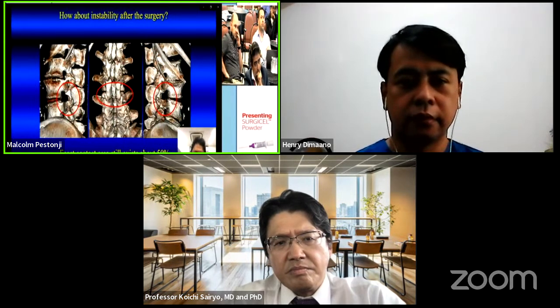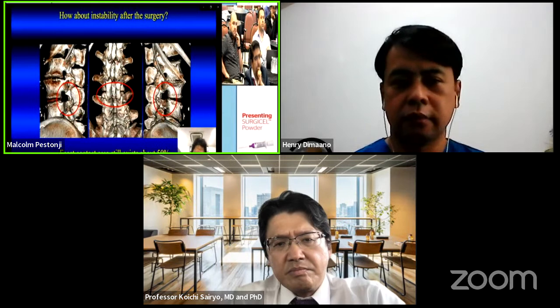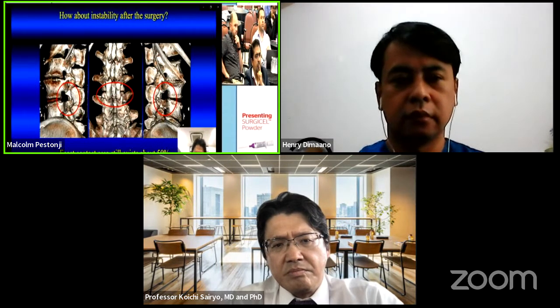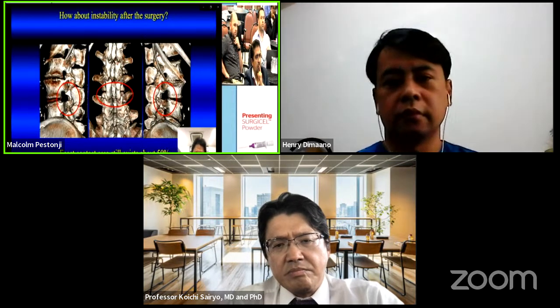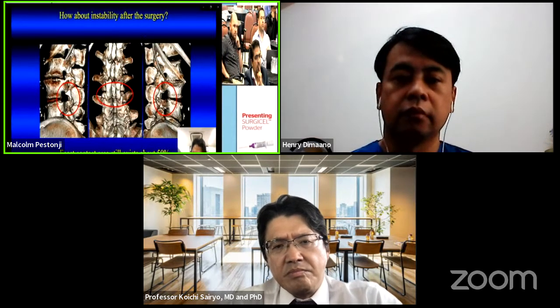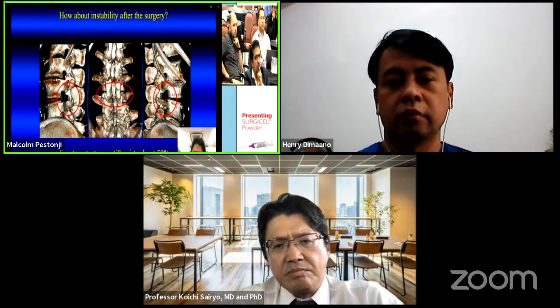After lumbar undercutting laminectomy, everybody is thinking that it's a major cause of instability. However, please look at this. Nice coverage of the facet bone because we do not touch this inferior articular process. So I do not have any instability after surgery.